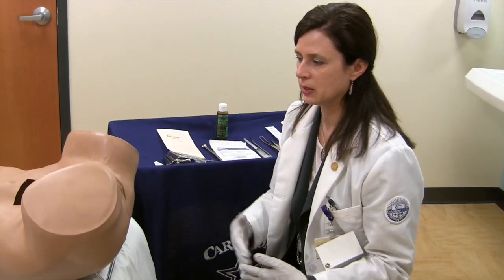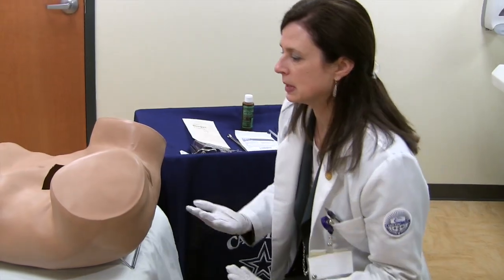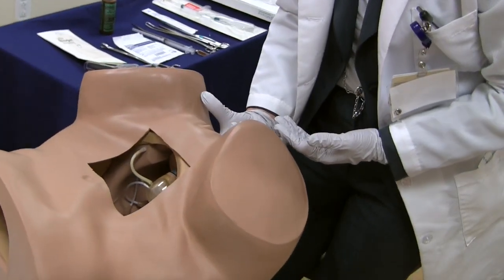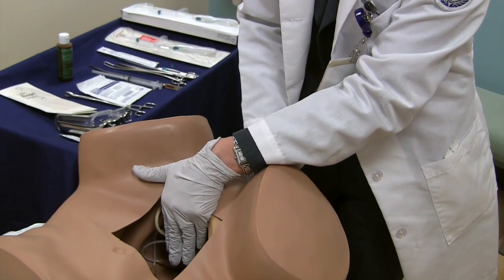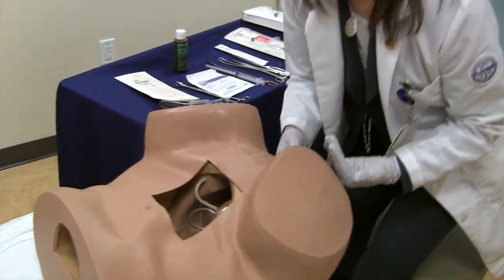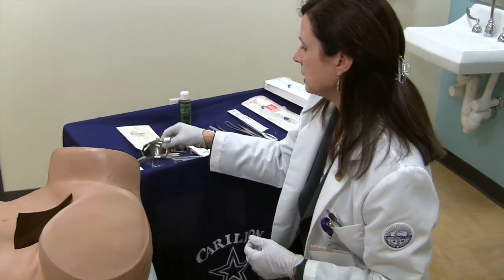For the IUD insertion workshop, this can be done whether seated in the clinic or in a conference room standing at the side of a table. Initially, we want to have the learner stand and perform a bimanual exam. This particular ZOE model has a retroverted uterus in place. It's helpful to talk through technique tips on how to determine whether the uterus is anteverted or retroverted. Once the position of the uterus is clearly identified, the next step would be insertion of the speculum.